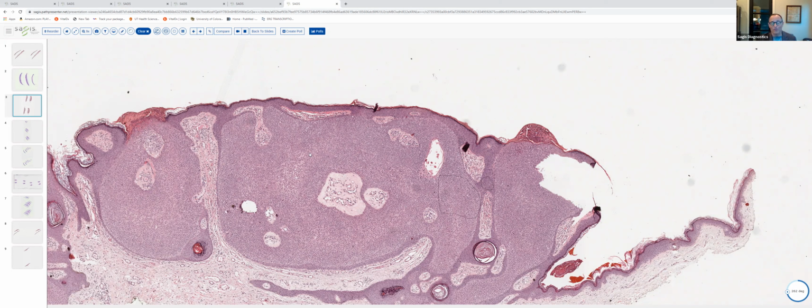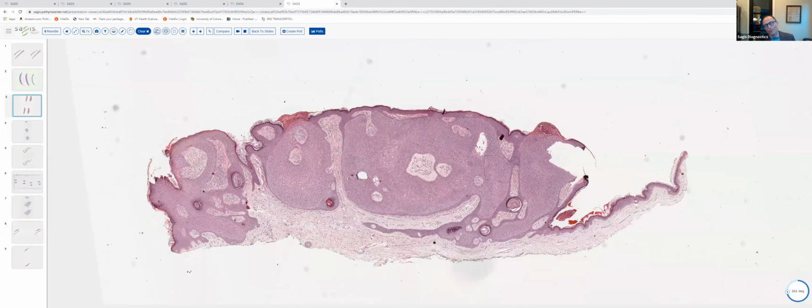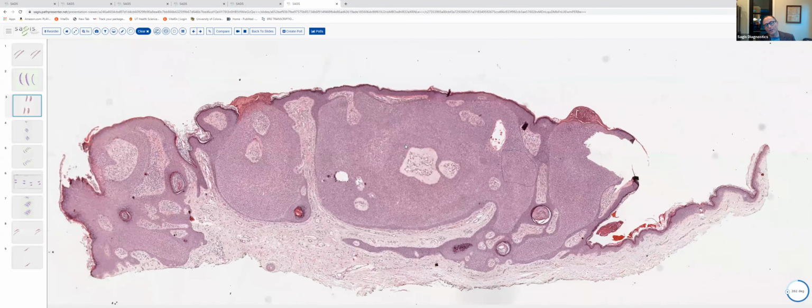And so you can see that there is a lot of histologic similarity, especially with the architecture between a clonal seb-K, uniform cells, no atypia, but no ducts, Bowen's disease, in which the nested aggregates have clearly pronounced cytologic atypia, usually overlying parakeratosis, and a Hidroacanthoma simplex, which, like the clonal seb-K, has nested aggregates of uniform cells, but typically shows ductal differentiation. And again, I find this edematous and somewhat vascular stroma to be a clue as well to the diagnosis of a Hidroacanthoma simplex.